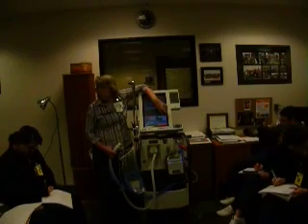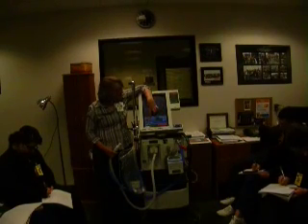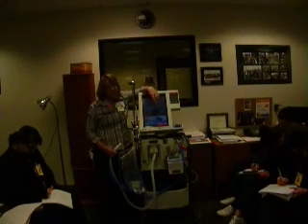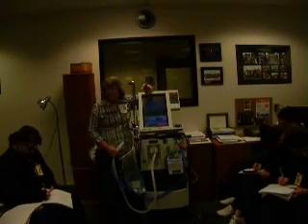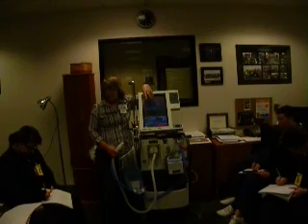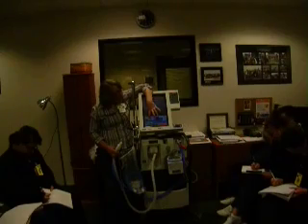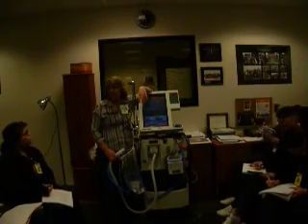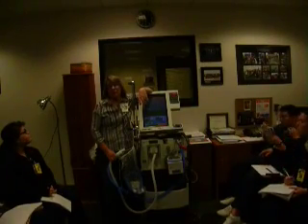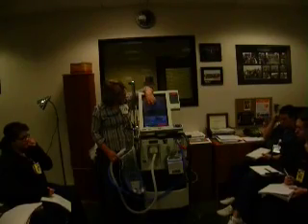O2, where you set your FiO2 that you want. Then the second row, TPL, is basically an inspiratory hold. It's plateau, but we don't use that. So that's always going to be on 0. If you put a time there, it's going to give you a breath hold at the end of every breath, which we don't do. That would be going like this. We don't use it, so it needs to be on 0.